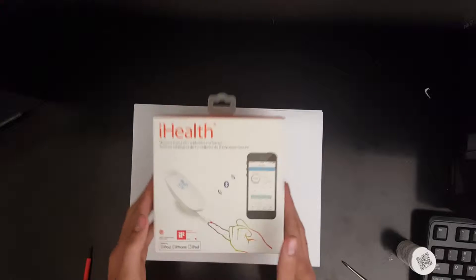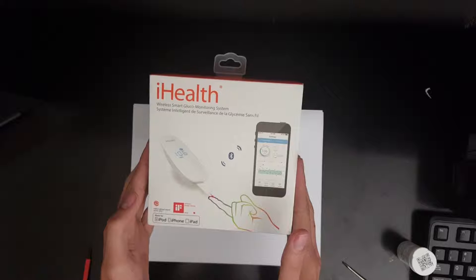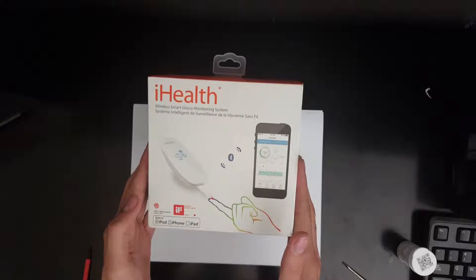Hello, this is the device teardown analysis of the iHealth glucometer from the brand iHealth Labs, which is a subset from the Apple Corporation.